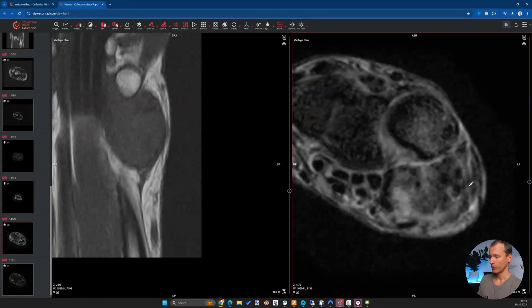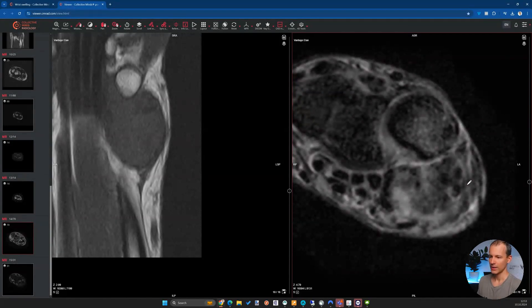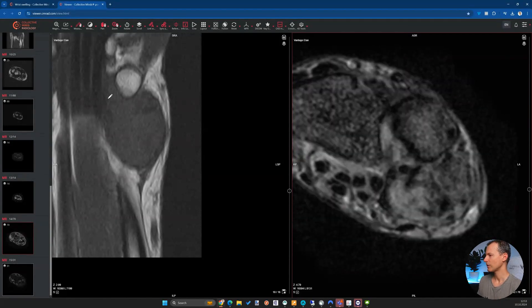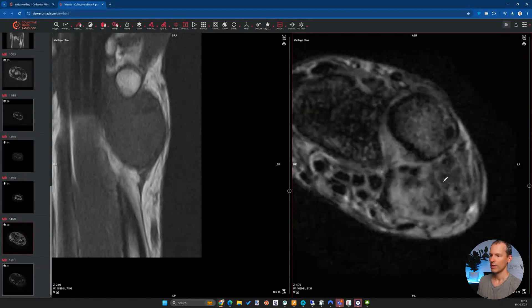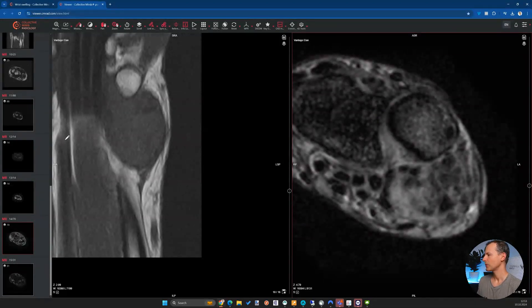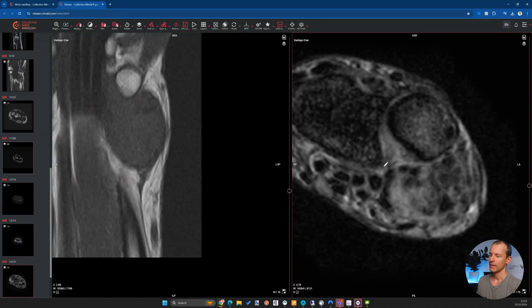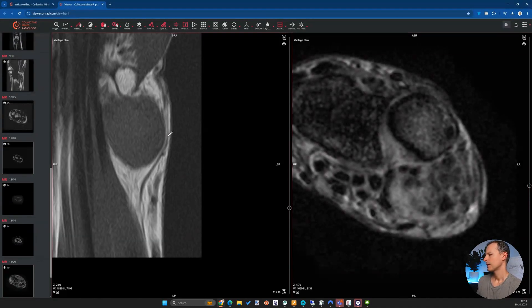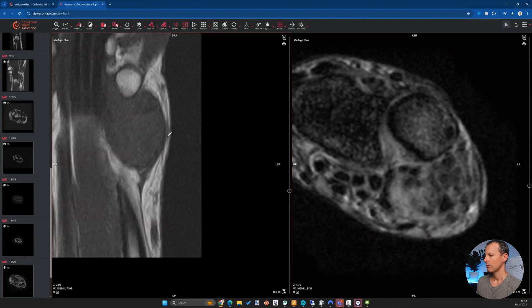Based on all the findings — a mass near the joint and tendons with blooming artifacts, low signal on T2, and the overall low signal pattern — this is most likely a tenosynovial giant cell tumor. The differential is most consistent with giant cell tumor of the tendon sheath, essentially PVNS.